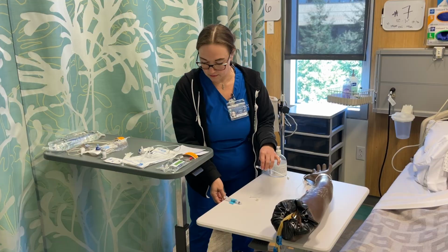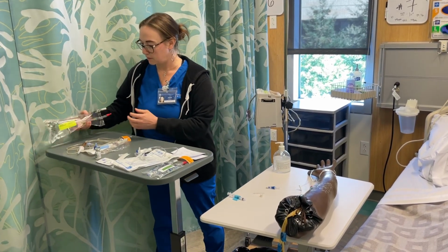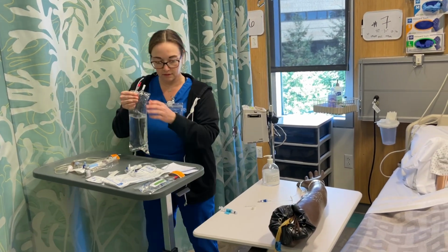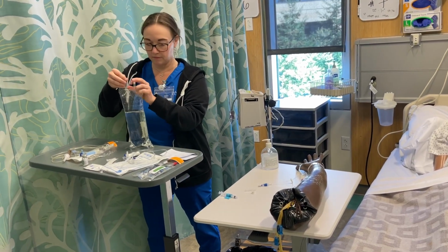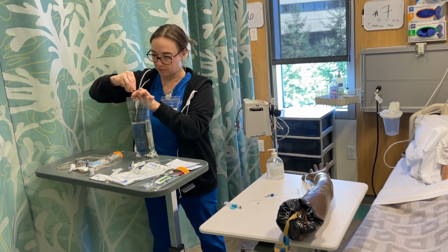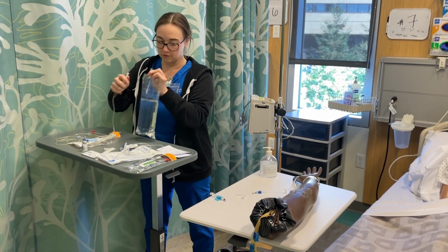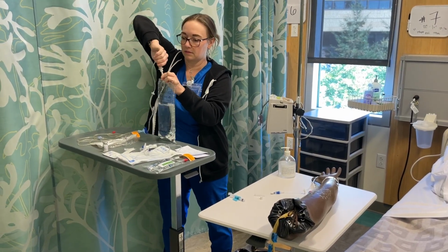And then toss that. Okay, and then next I'm going to be setting up the primary, and that is labeled on here. And this is 125 milliliters of normal saline. And that's going to be at a drip rate of 5 drips per 15 seconds. I'm going to spike and prime the bag.